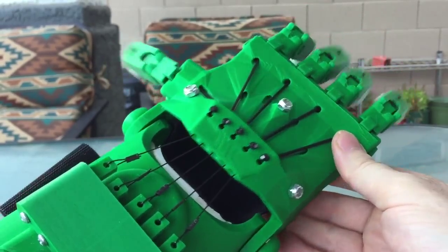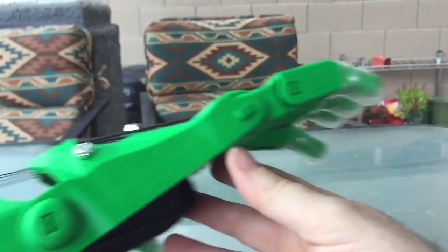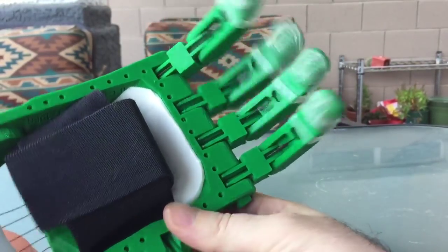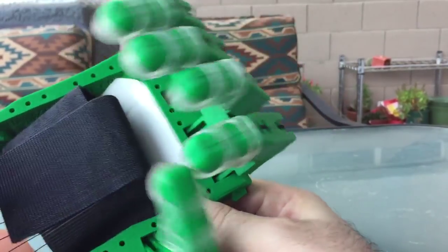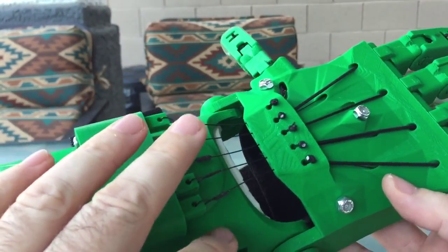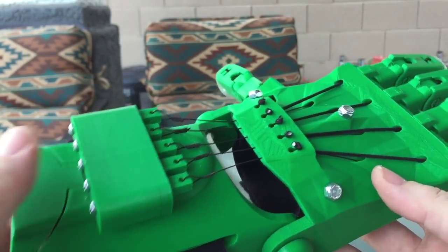Now the action is — you can see it pulls closed. The action's real nice there. And it's so much faster to put on. This took me maybe about 15-20 minutes to put all of these on.